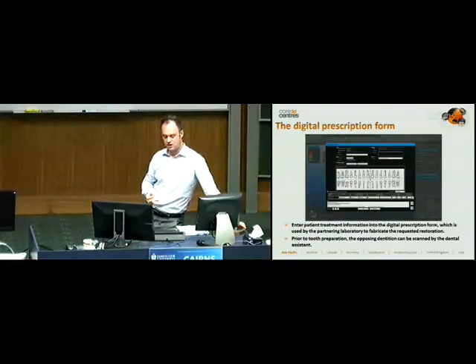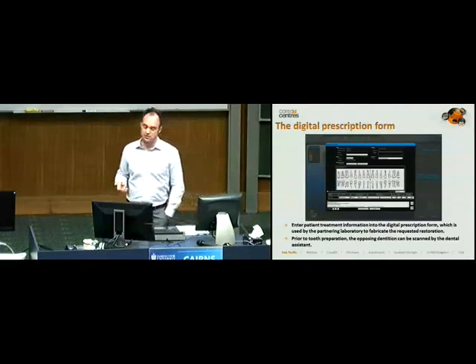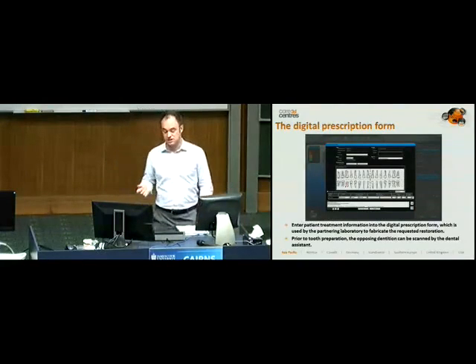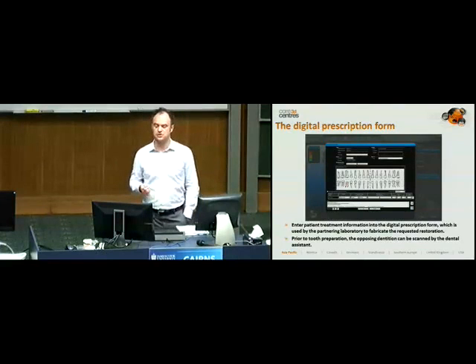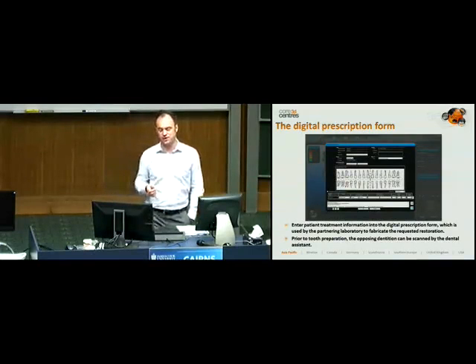It's going to be called Cara, and I've also seen 2 other technologies that are out there, and they're all basically the same, give or take how they look. They're all basically the same premise. The first thing you do is fill in an RX, okay? Now, you can see on the screen a chart, and all you have to do is chart the area you're going to scan, because it will then tell you exactly the angle and position of the camera for that particular point.